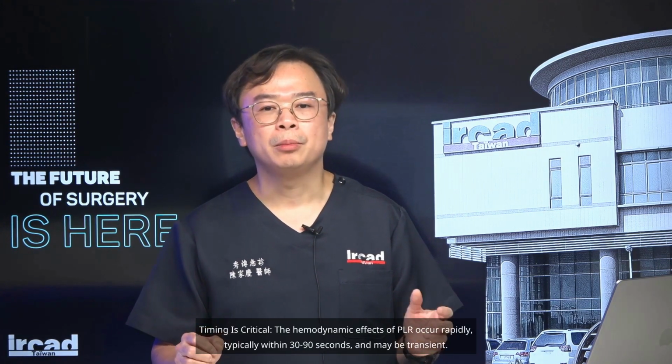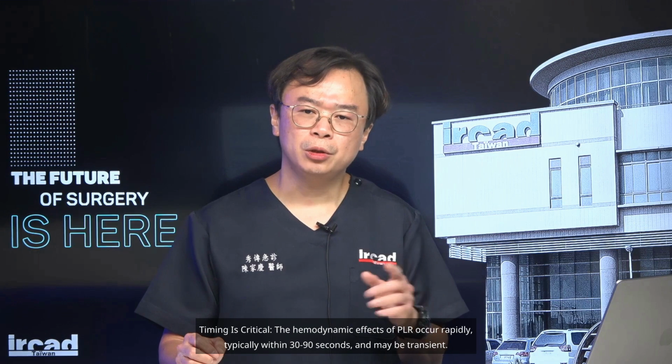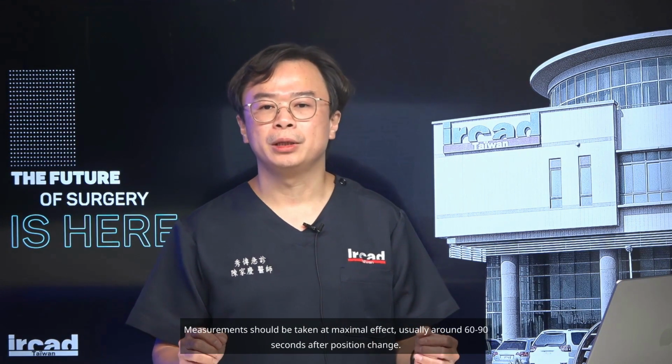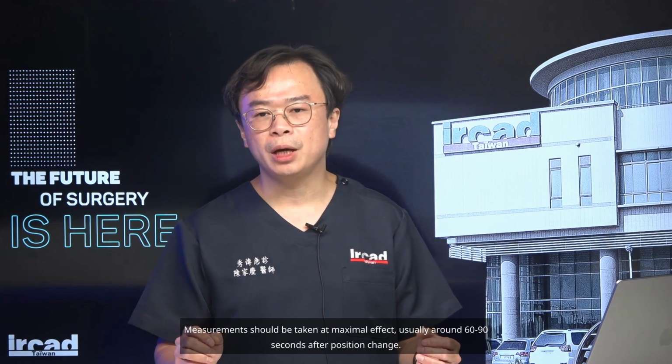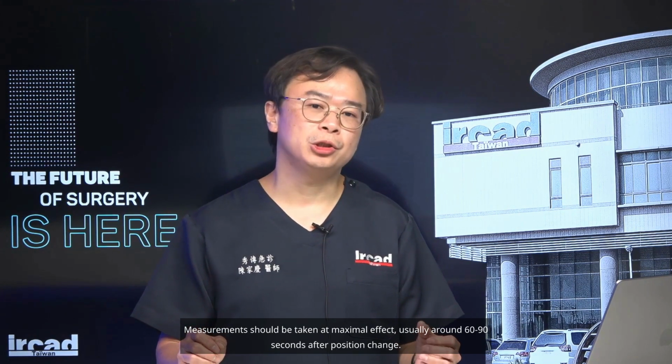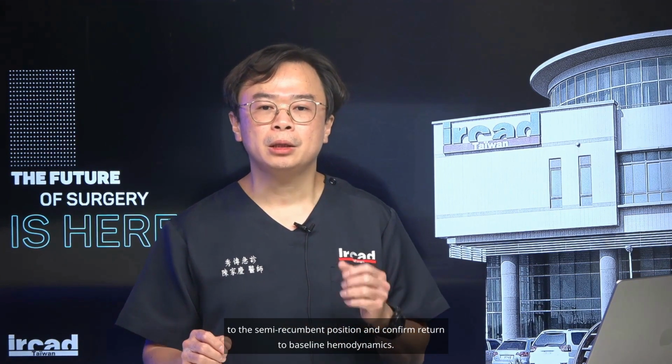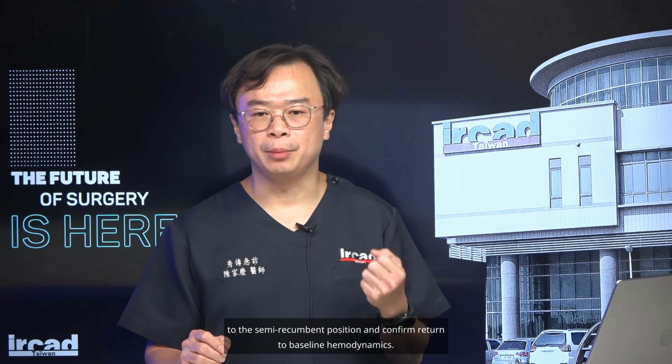3. Timing is critical. The hemodynamic effects of PLR occur rapidly, typically within 30–90 seconds, and may be transient. Measurements should be taken at maximal effect, usually around 60–90 seconds after position change. 4. Return to baseline. After obtaining measurements, return the patient to the semi-recumbent position and confirm return to baseline hemodynamics.